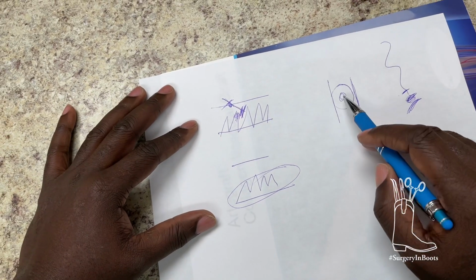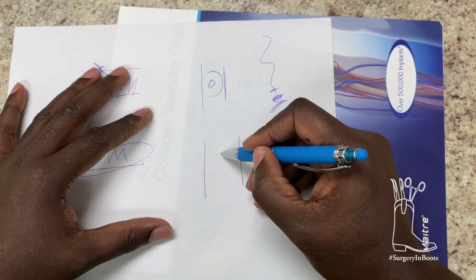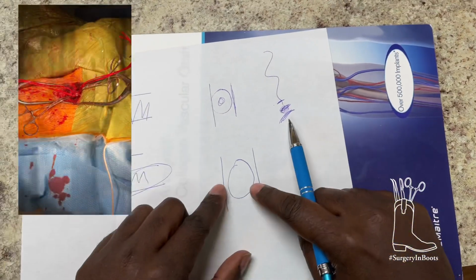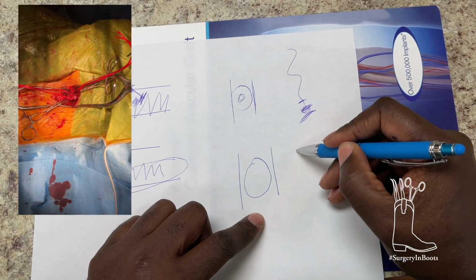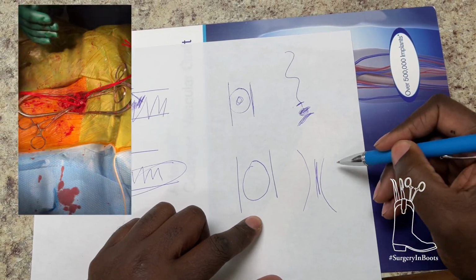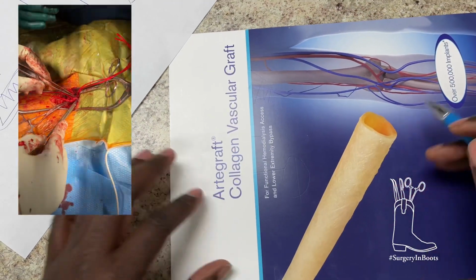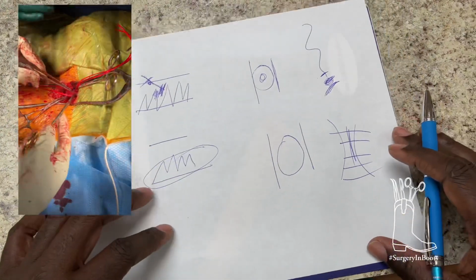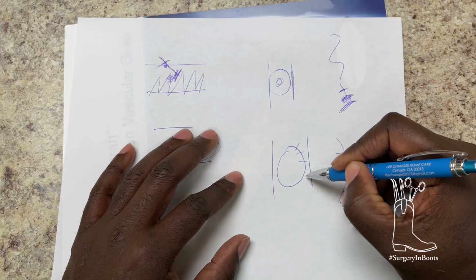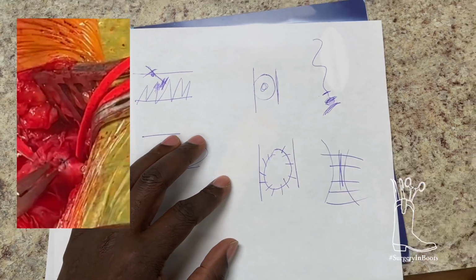You can't do that through that tiny hole, so we had to make a big hole. Now you have an artery that looks like this with a big hole. The only way to fix that, because you can't just close it straight, since the artery would look like this. That doesn't work. So what we do is use a patch, usually made by this company, from bovine pericardium. So take a cow heart sac, cut it out, boom. Then we take that patch and sew it in place.